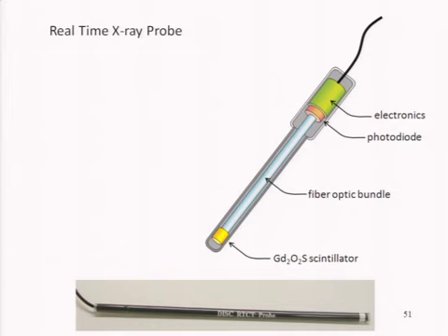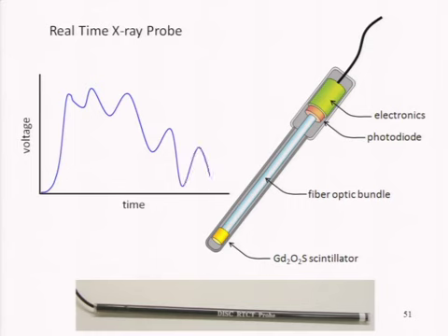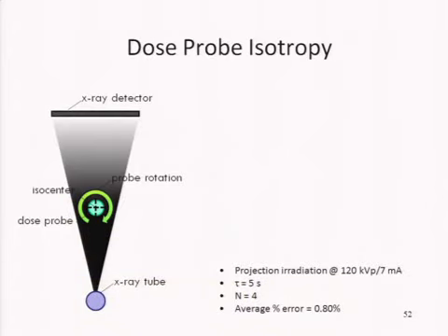The criteria are that it has very fast output, on the order of 1 to 5 kilohertz, which is not our MDH or Keithley meters today, although a Piranha or things like that, RTI makes some of these, and I know MDH is working on it. This one I got from a different manufacturer.